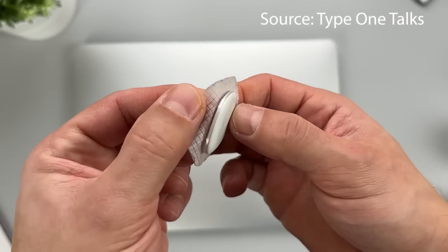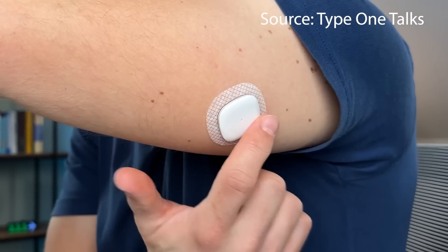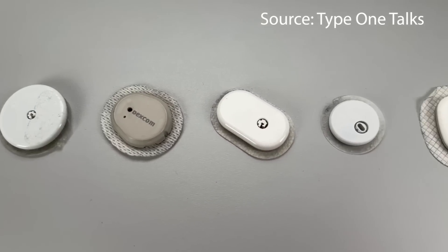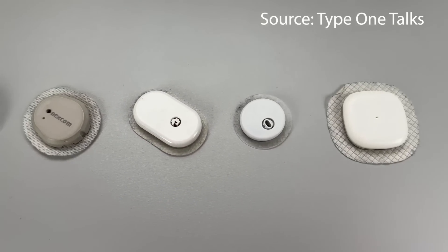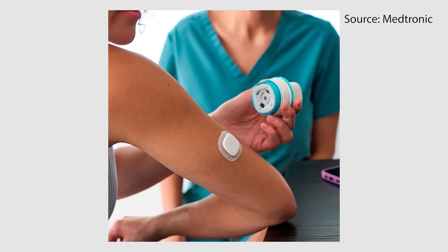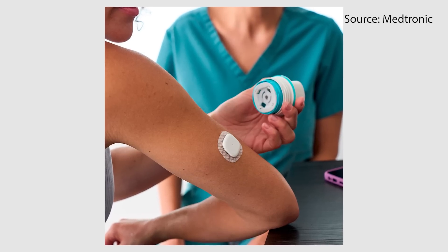The Simplera is 50% smaller than the Guardian 4 and much sleeker. When you look at it side by side with other CGMs — thank you Tom for this footage — you can see it is pretty comparable to other CGMs, probably about the size of the Freestyle Libre 2. It's a lot slimmer than its predecessor and overall a prettier looking device.